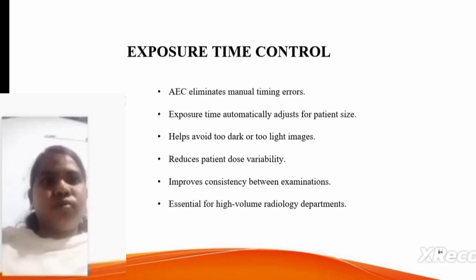Exposure time is automatically adjusted to the patient size. This helps avoid too dark or too light images.